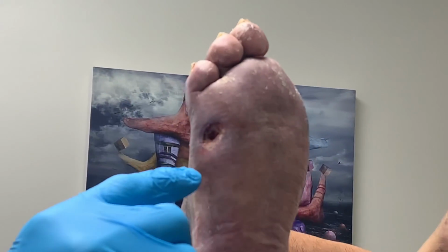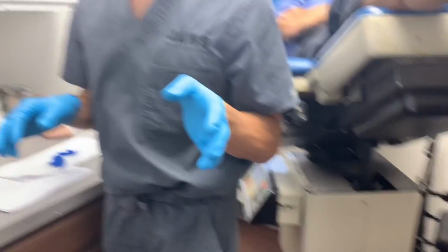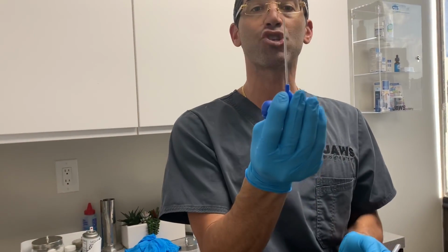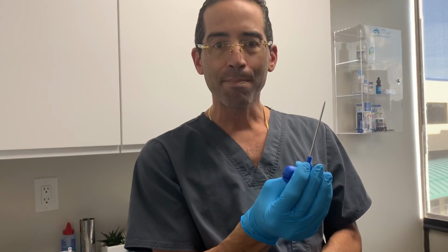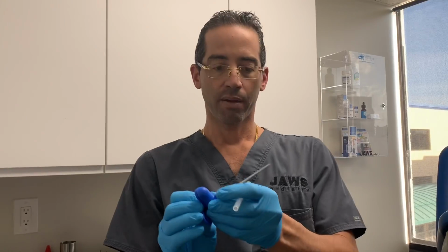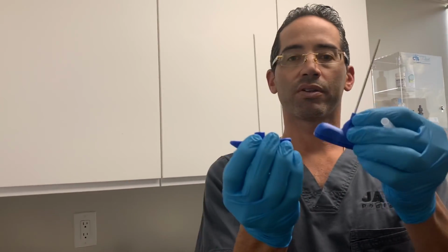Thank you. So we're gonna go ahead. Let me show you guys. A bone biopsy is a bone biopsy is a bone biopsy. It's doctor's preference whether you use any instrument. I'm not gonna throw big names at you, but what we do have here is something specifically made for bone biopsies. It's called the Jamshidi needle. Jamshidi, like let's jam, right? I'm sorry. Are you guys laughing with me or at me? With you.